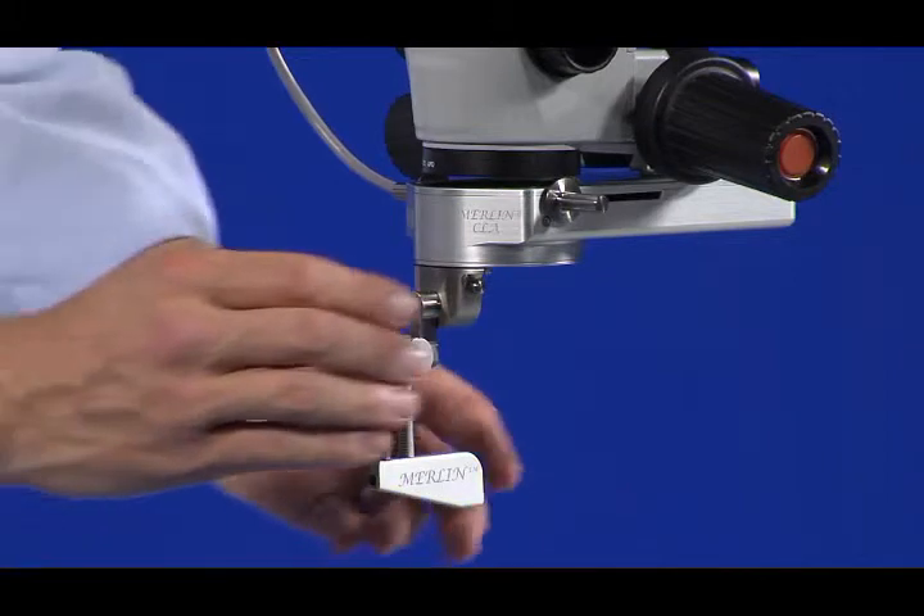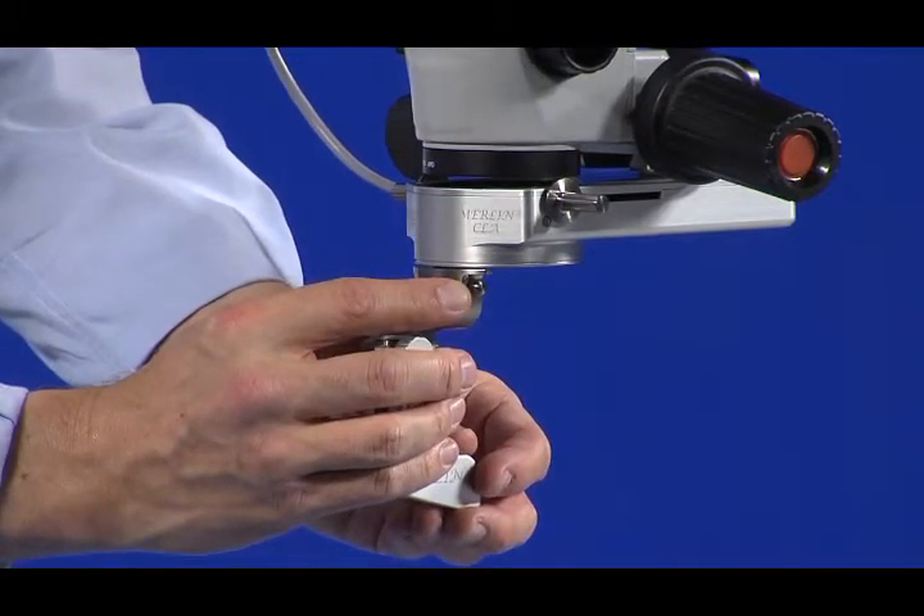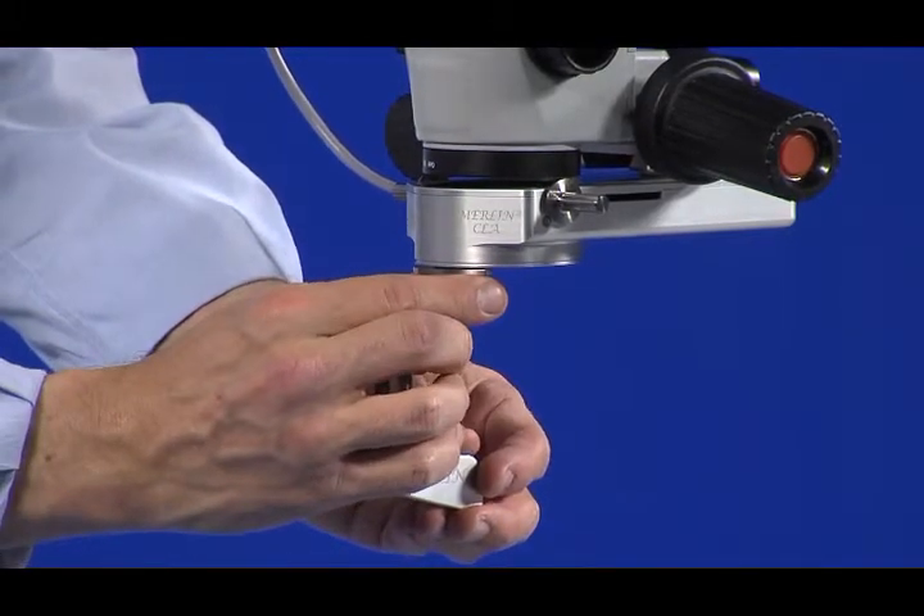The LPU is disconnected from the CLA by pressing the Quick Disconnect button and gently pulling down.